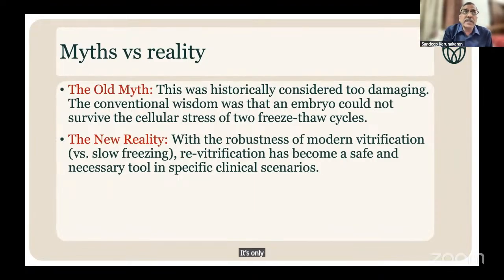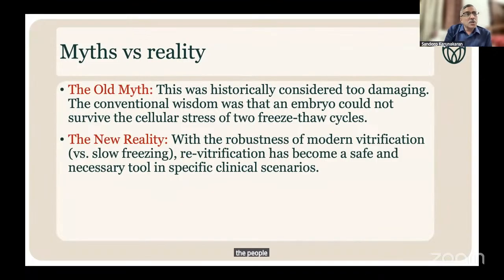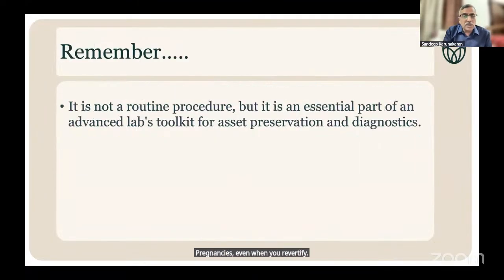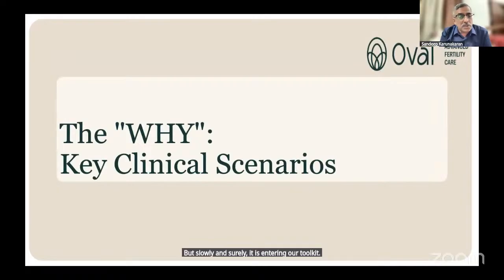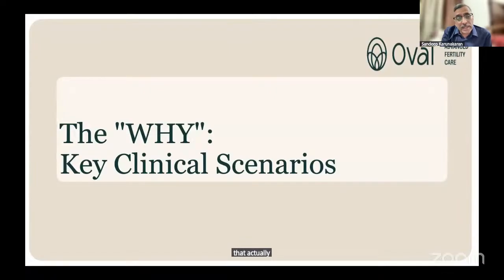It's only very recently, when some inadvertent incidents forced people to freeze the frozen embryo again, that people realized it can actually give pregnancies even when you revitrify. So one should remember that it is not a routine procedure, but slowly and surely it is entering our toolkit. So without wasting much time, let's see why we should do revitrification and what are the possible clinical scenarios that entail us to do this procedure.